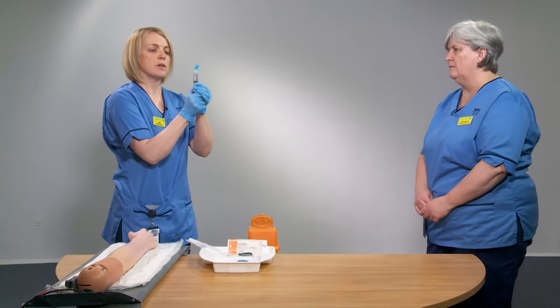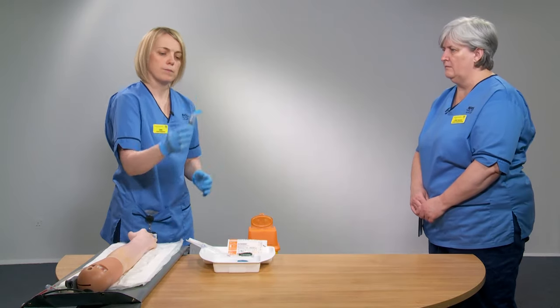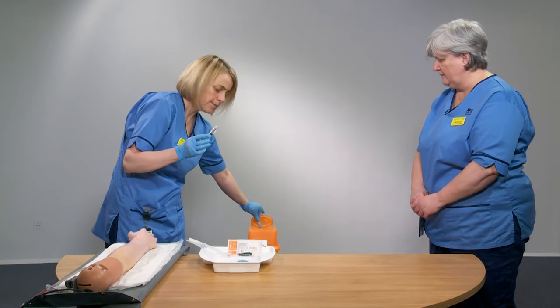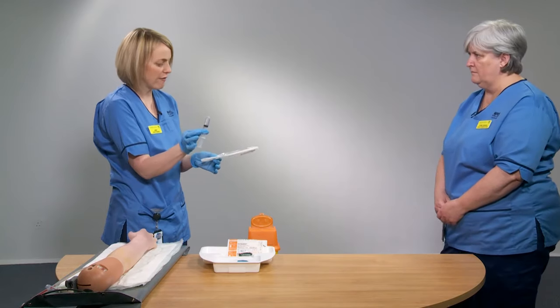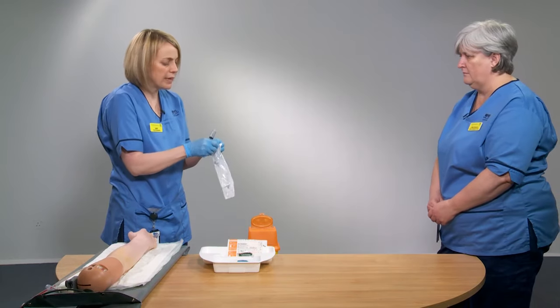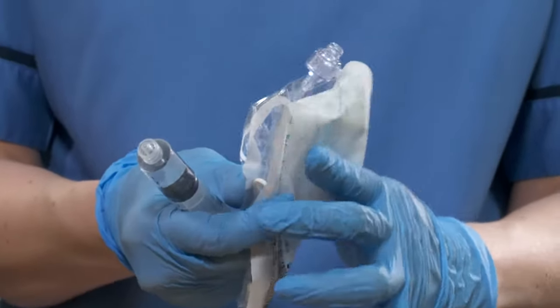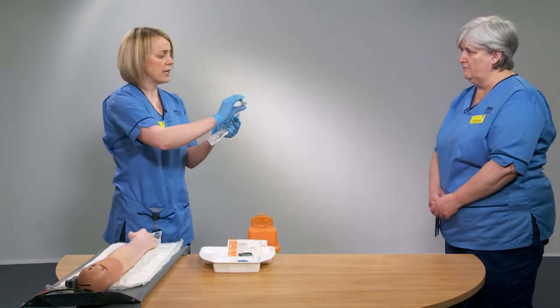Pull back to get rid of any air bubbles and then activate your safety device on a hard surface. Remove your needle and pop that in your sharps bin. Then what you want to do is attach this 10 ml syringe with your five mils of saline to your needle-free access device and prime this device. Peel your packet open to reduce the risk of any contamination.